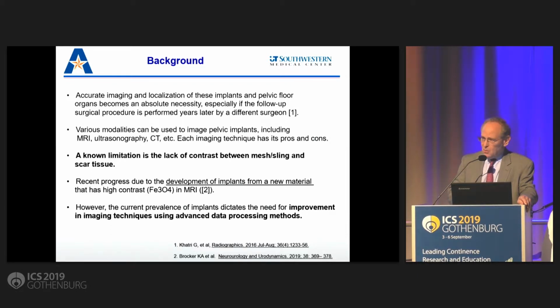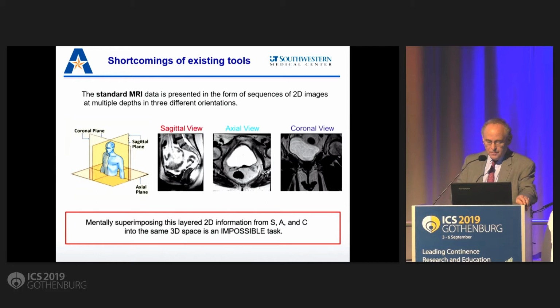And there has been some work done by John Delancey and his group to try to basically render these implants visible. And we're looking at a different way to look at that, which is improving our imaging technology and using advanced data processing methods to do that. So here's the example of what we're struggling with.